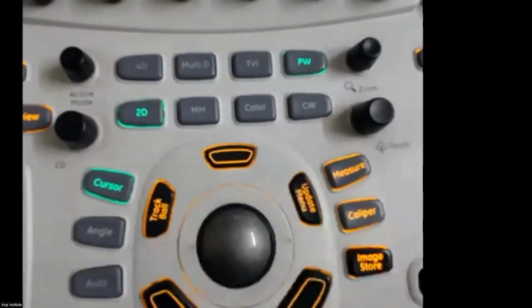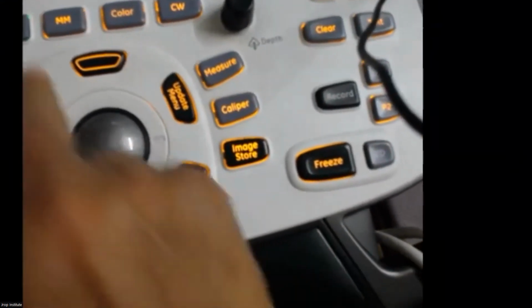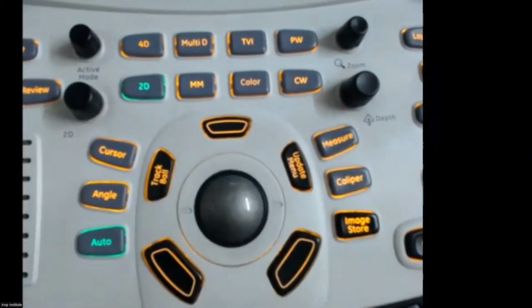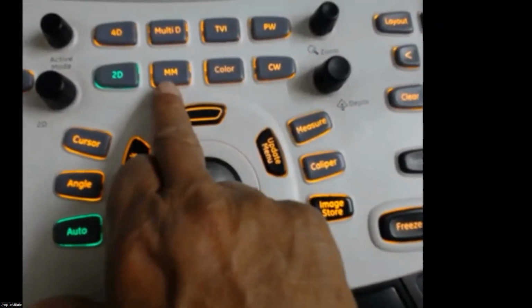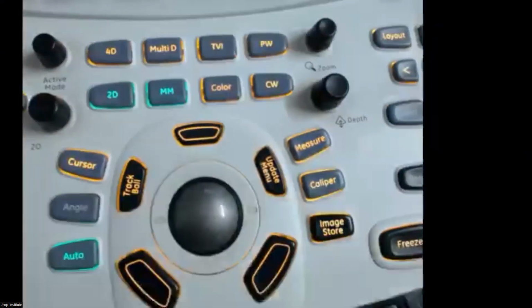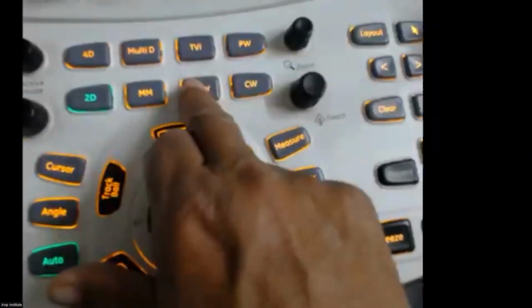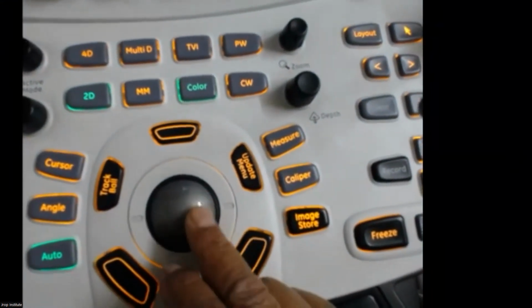In this machine, there are buttons. First of all, this button is freeze. So I'm unfreezing it. Look, my machine has become unfrozen. Now this 2D button is there for the single 2D image. Now this M mode. So I'm doing this as M mode. Switch off M mode, I'm going to color. Look, this is the color box which has appeared over here.